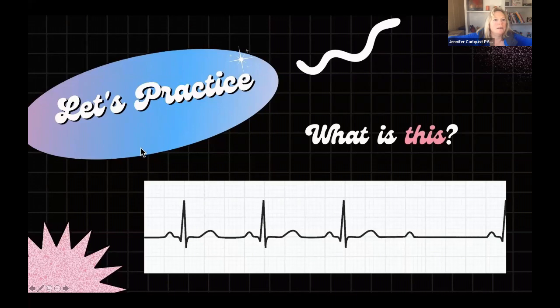Oh, look at that. We got some guesses on Zoom. We got Michelle saying that this is a second degree type 2. I will agree completely. And Anoop says type 2. Chris says type 2. Very good. Okay, can't fool you guys with the heart blocks. Julie's on there saying, what's up? Okay, so let's look at this real quick.